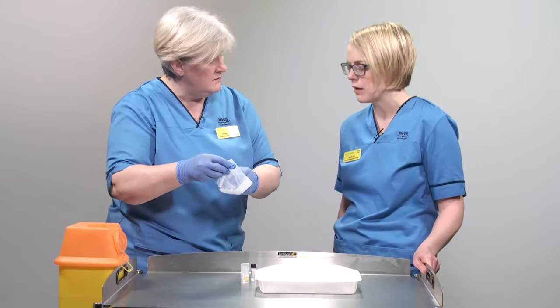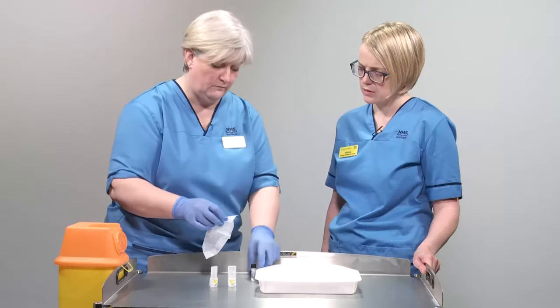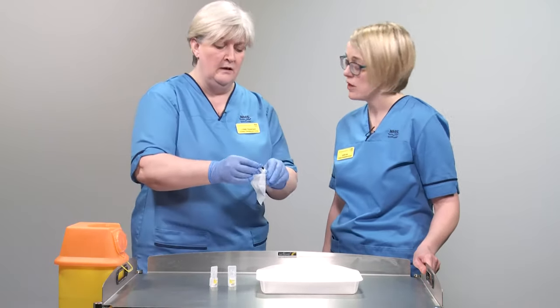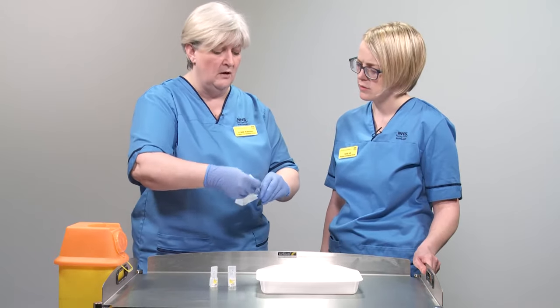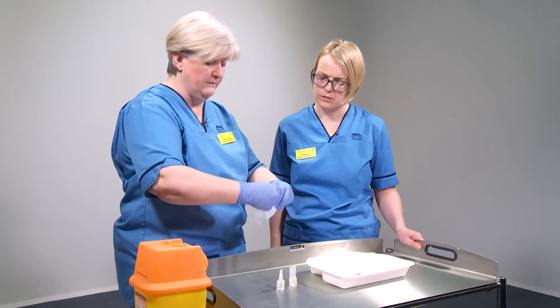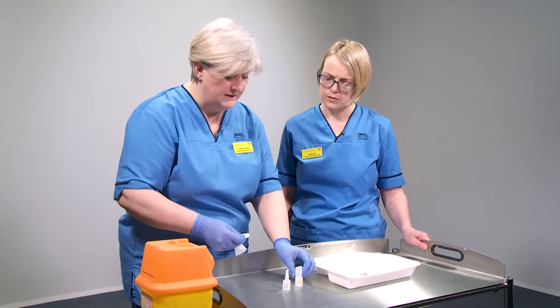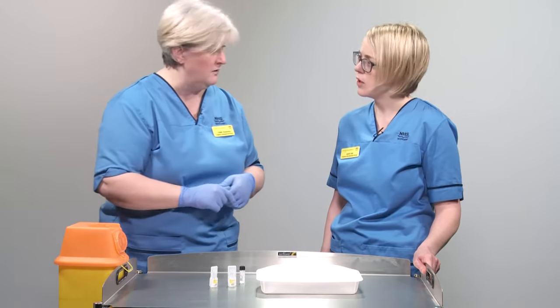We make sure we're cleaning the necks of all the ampoules we're using because although they may seem clean, we can't see the bacteria that might be on them — we've taken them out of a cupboard and other people could have handled them without cleaning them. So it just makes sure we're being as clean as possible. The top of the medicine vial gets cleaned as well. Even if the vial had a little metal shield in the top to protect it during transit, once that's broken off we clean the top of the rubber, and the neck of any glass ampoules. Once done, put them in a place where we won't touch them again to prevent contamination; the wipe goes in the clinical waste.